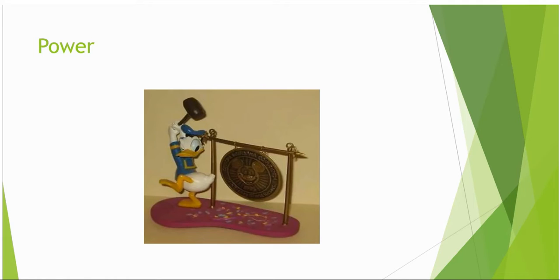Power. Power relates to the strength of the voltage signal that is applied to the probe crystals. You could consider the probe to be a gong or a bell. The harder you hit the gong with a striker, the louder the ring. Now there are a few important considerations for power.